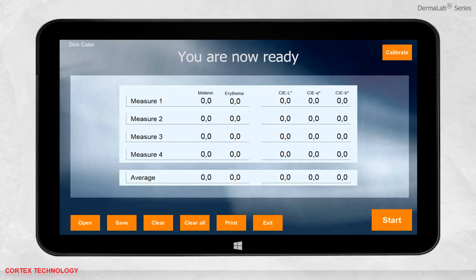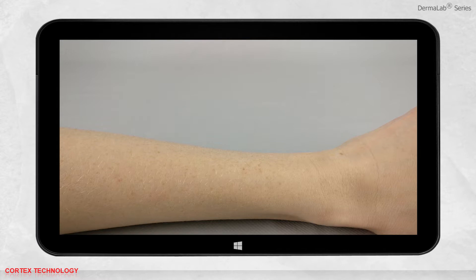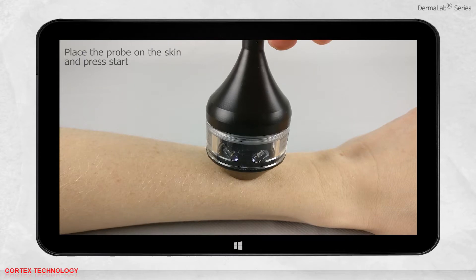You are now ready to make a measurement. Place the probe on the skin and press start to perform the skin color measurement.